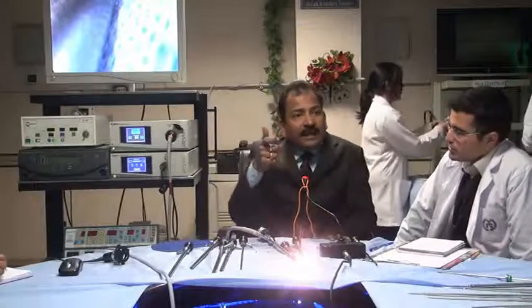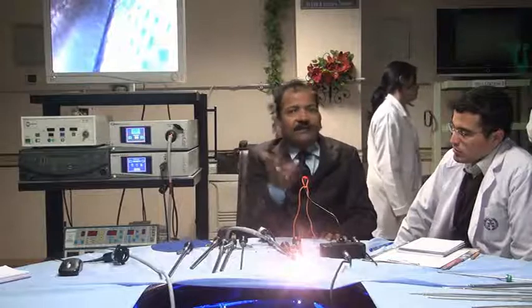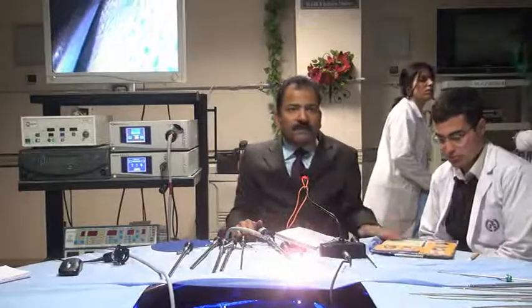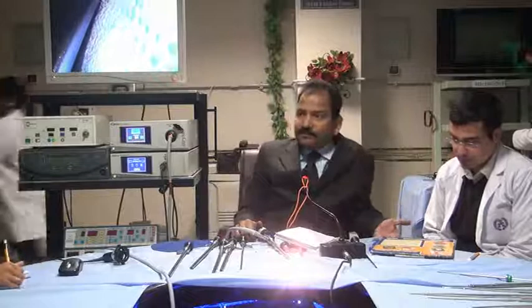But it should be in the proper hand. Otherwise it will disturb you also, because the people will give you the camera from the wrong angle and you will be in the wrong orientation. The advantage is, suppose this is a uterus, and this is the posterior wall of the uterus. Now I have to see it.